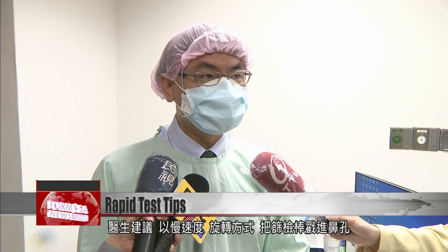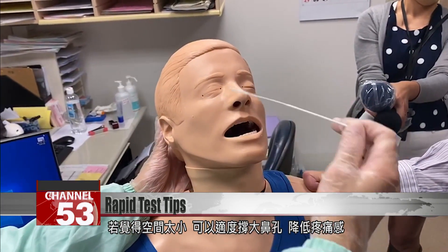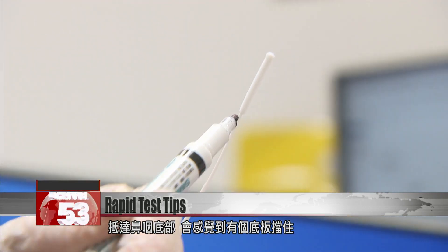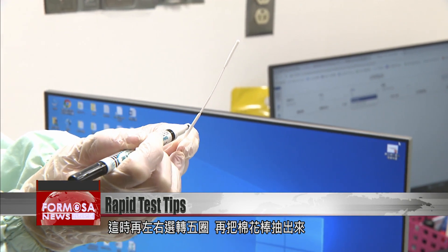The doctor says it's best to insert the swab slowly with a twisting motion into the nostril. If the space feels too small, you can try flaring your nostrils to help with discomfort. Once the swab reaches the back of the nasopharynx, it will feel like the stick has hit a wall. At this point, rotate the swab left and right five times and take it out.